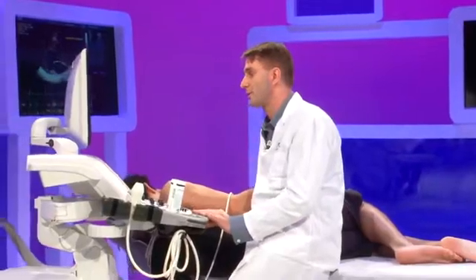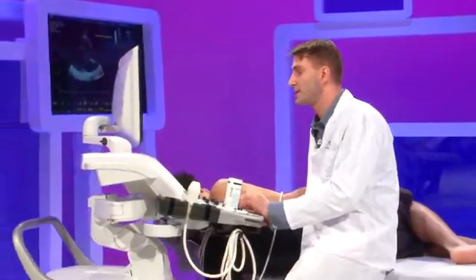The best frequency to use is the center frequency of the probe. If you have small patients, children, you need a higher probe frequency, because the higher frequency will give you a better resolution, but will give you less penetration. The lower you go with your probe frequency, the better the penetration will be, but the less the resolution will be. And probes do function the best at their center frequency. So, there are occasions that you can step away from second harmonic imaging. However, in default mode, it's advised to use as much as you can this second harmonic imaging.